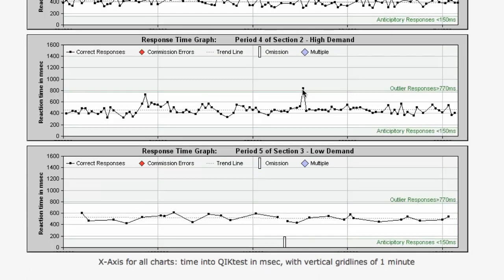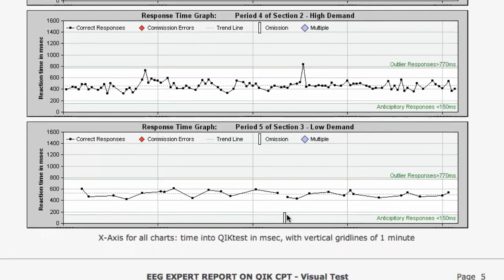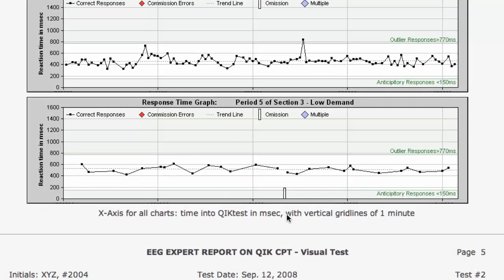Here we see our outlier. This person slowed way down here and crossed this green outlier line of 770 milliseconds — that's what's relevant for this age and gender for this segment of the norm. We see this slow outlier here, and that was counted. Here we almost had an outlier, and then here we had a full omission error in this fifth period. We're seeing full omission errors in this fifth period sometimes, and it's wonderful that the Quick Test has this fifth period — a slow segment — rather than running fast all the way to the end.